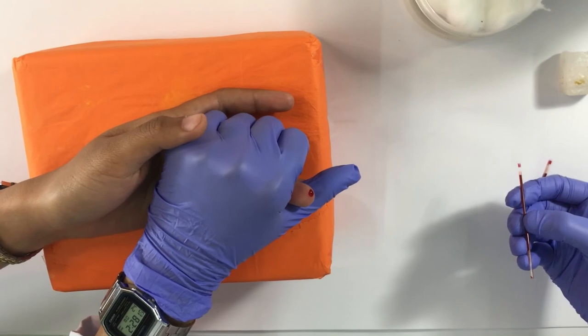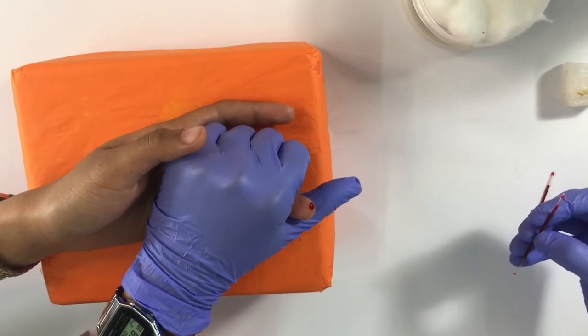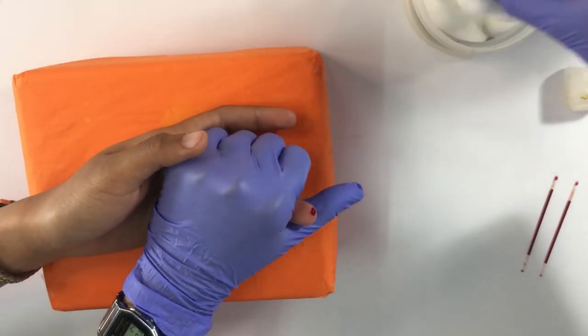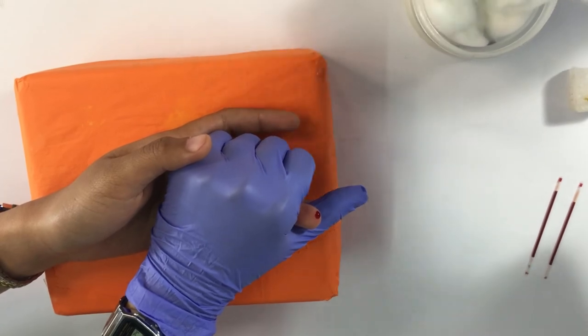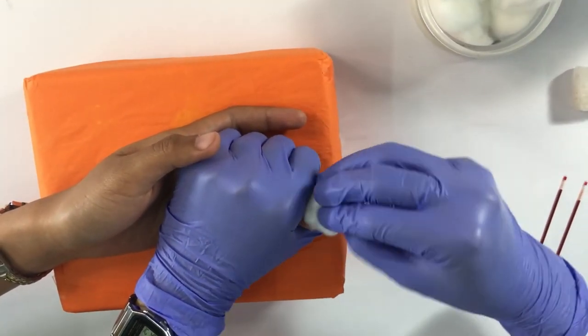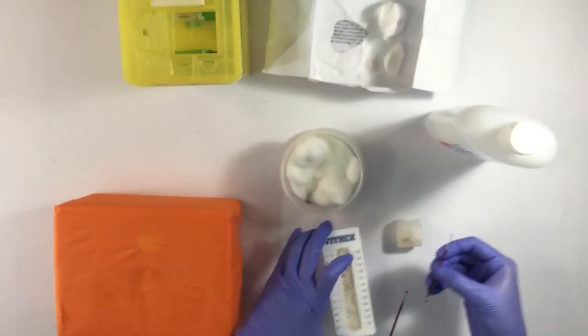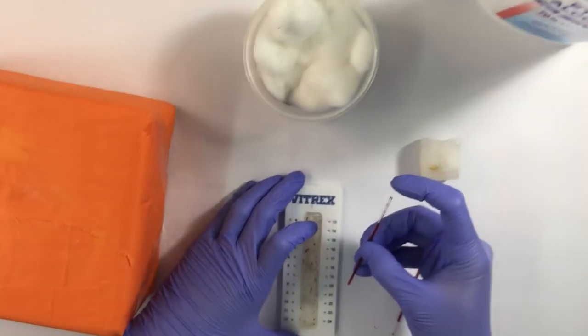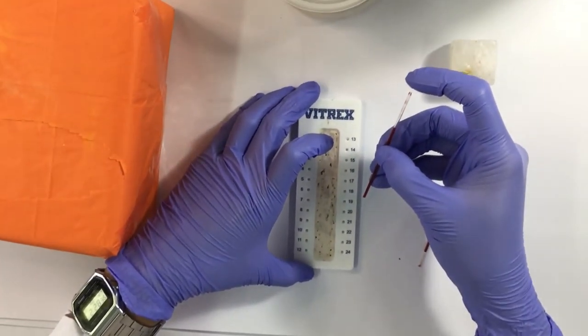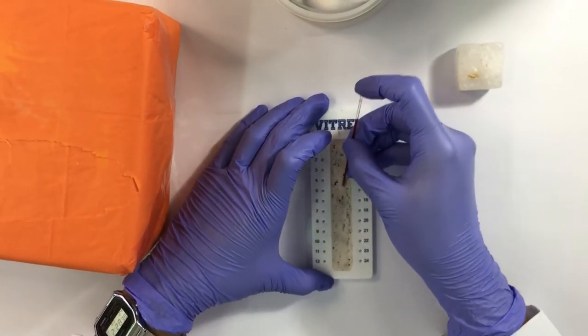After which, perform patient care. Patient care involves applying clean, dry cotton on the site of collection and instructing the patient to apply pressure until bleeding stops. The capillary tubes must be properly sealed with clay sealant first, followed by paraffin wax.